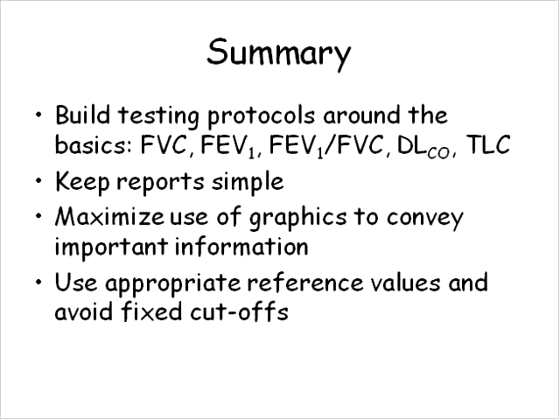Okay. Greg, there's one here about when doing a complete pulmonary function test with BD, I'm not sure what that is. Oh, with bronchodilator. Okay, so at what point when doing a complete PFT with bronchodilators is it recommended to administer the bronchodilators? That's the question. Okay, I see.